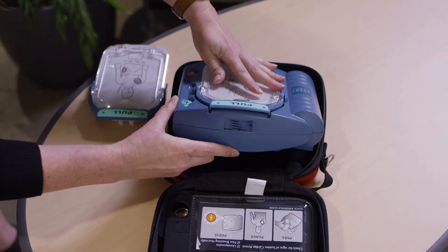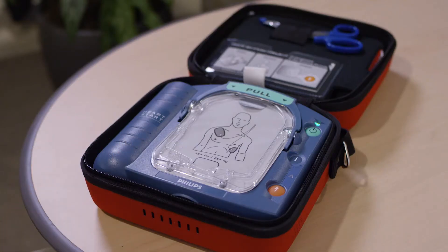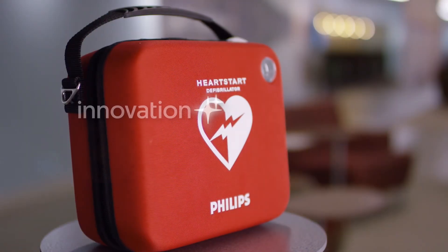Each OnSite AED does its own self-testing every day. All you need to do is make sure this green light is blinking.